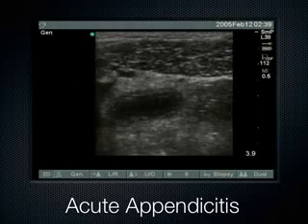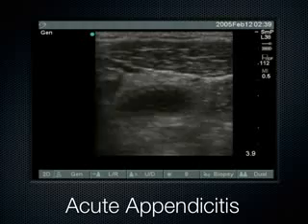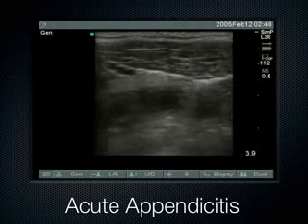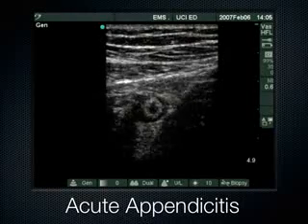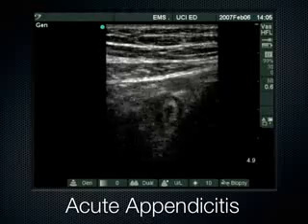And there's some psoas down here. We're squishing. Here's some part of the psoas here. There's another part down here. We're squishing the appendix up between psoas and abdominal wall musculature. Just another example of another patient with acute appendicitis. It starts to take on this characteristic blind-ended tubular structure.